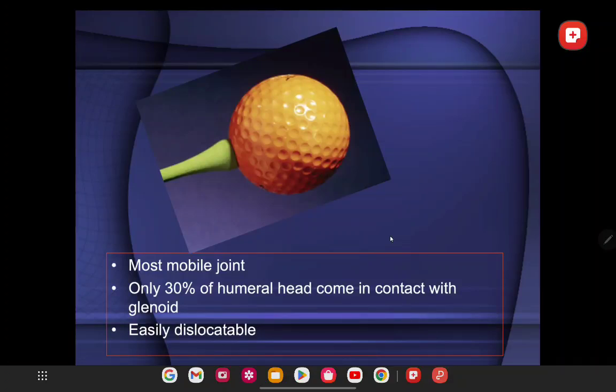A few ways of doing ultrasound shoulder when Anik and one of your other colleagues was there. So you may have some idea, but not a lot. I completely understand. So both of these techniques are complementary. So you will get information from the ultrasound and you will get some information from MR.